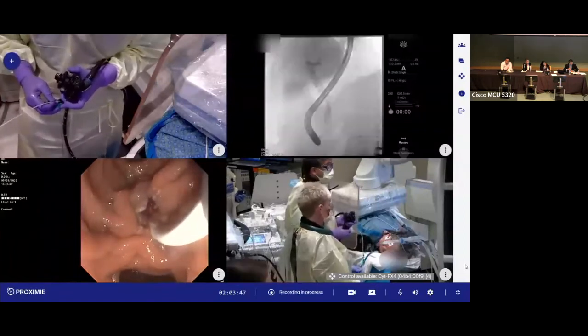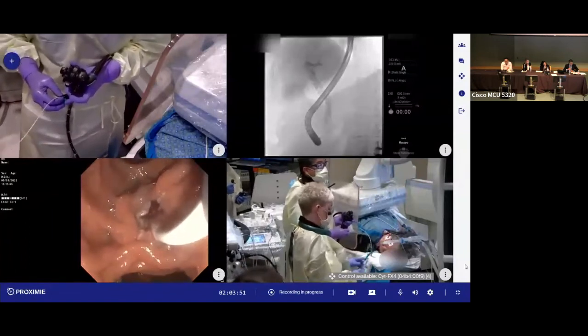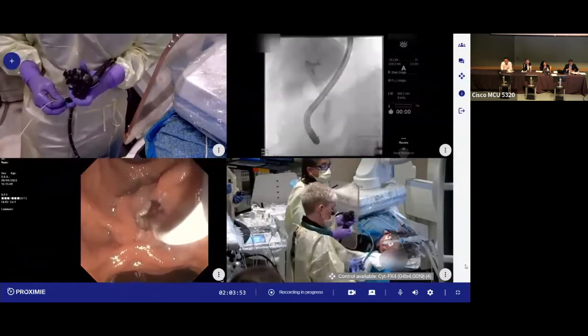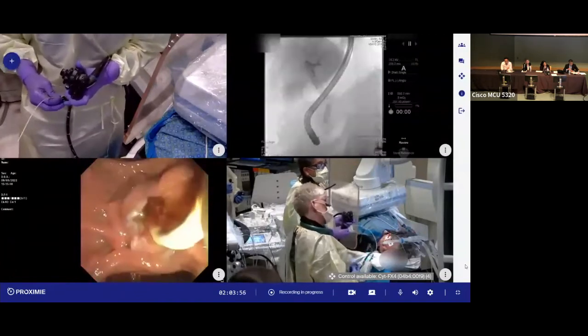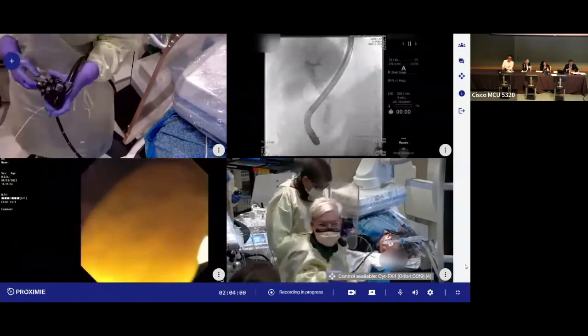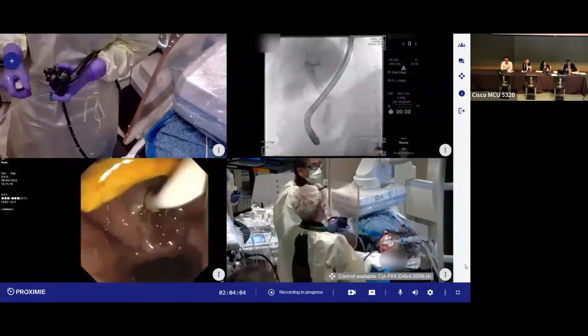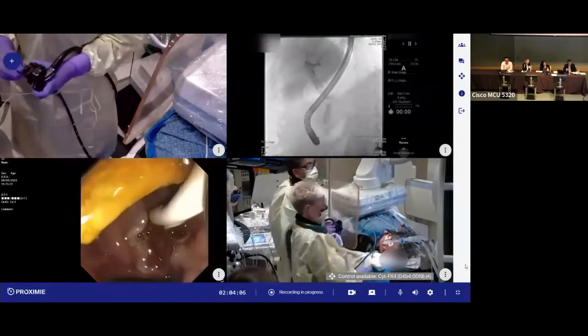So I'm going to use my reference image, try not to take too much off. Go to 9 here. It reminds me of, oh, there we go. Did you see that endo image? Oh, nice. All right. Carrie, I want to see that passion. Sometimes you didn't hear me. So the maneuver, that's one stone.